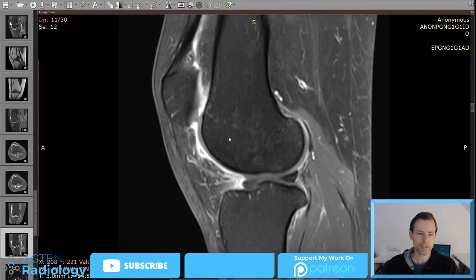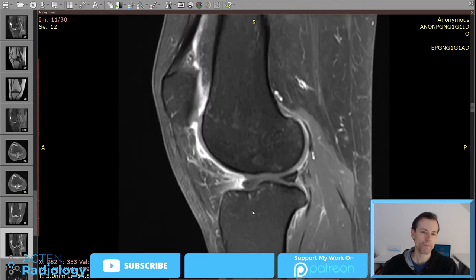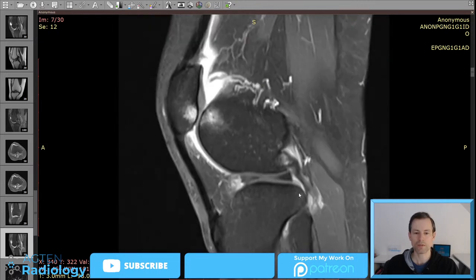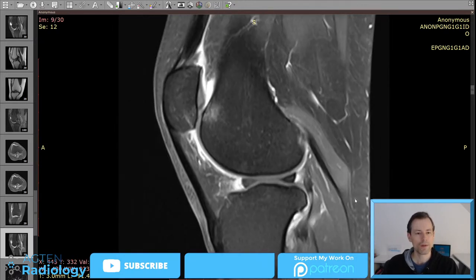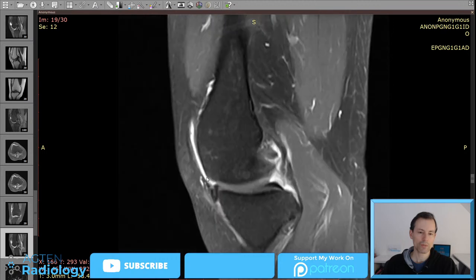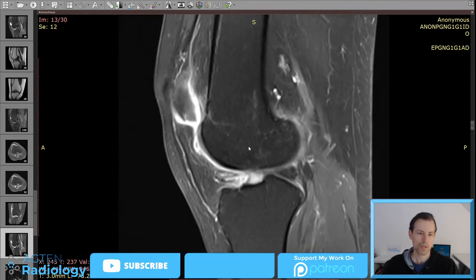So what I would suggest in such cases, I would just leave it open, because you don't want to mention, okay, there is now synovitis because the patient has background inflammatory arthritis or whatever. I would just stick to the terms. It's synovial enhancement with synovitis, no effusion. Put it down there, and then you can give two differentials. It's either from the background arthritis, depending on the clinical situation, or it could be secondary because we have this kind of meniscus pathology on the medial side. We have also this osteoarthritis in the femoropatellar joint. So that's it.